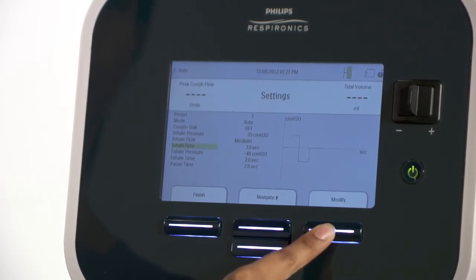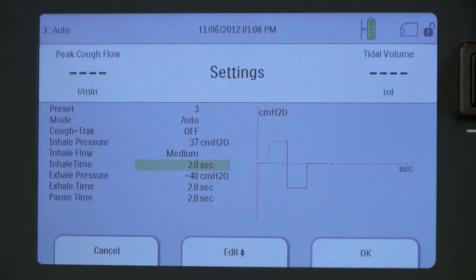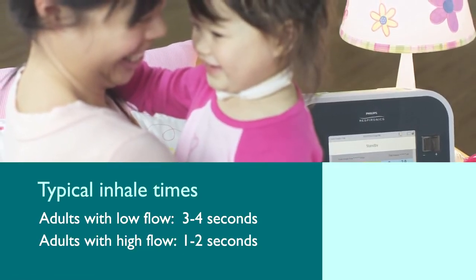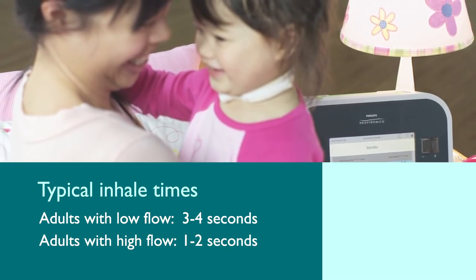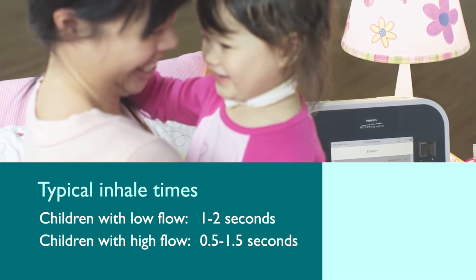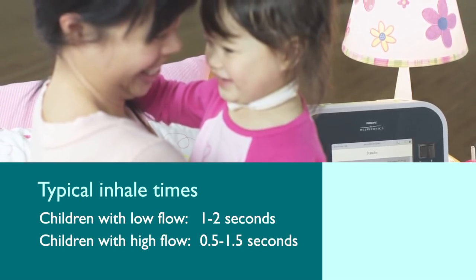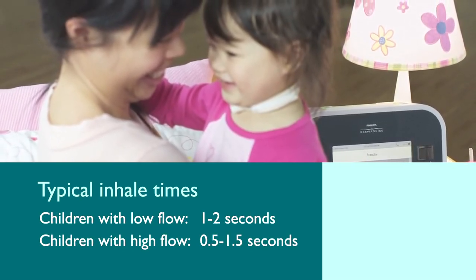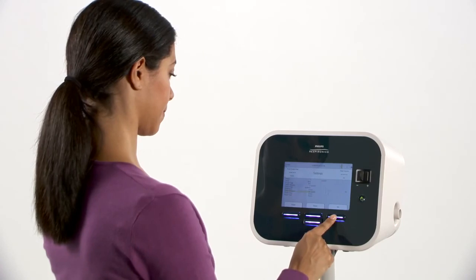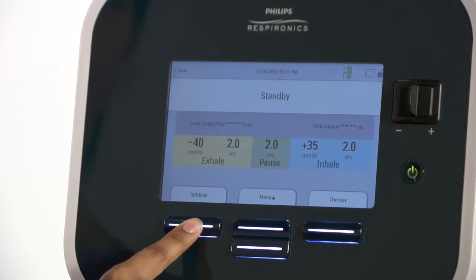Use the right button under Modify to highlight inhale time. A typical inhale time for adults with a low flow setting is 3 to 4 seconds, 1 to 2 seconds in adults with higher settings. For small children with low flow, 1 to 2 seconds is typical, 0.5 to 1.5 for high flow. OK accepts the new inhale time. All the settings listed can be adjusted in this manner. When you have made all of your modifications, press the left button under Finish to return to standby.